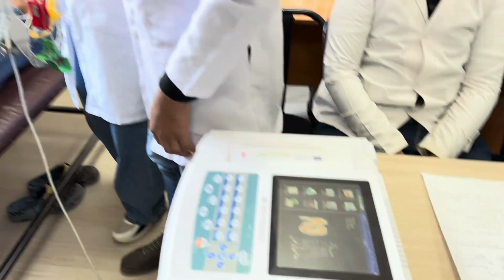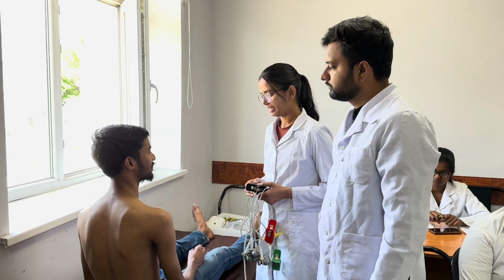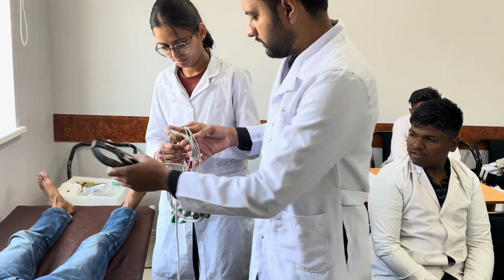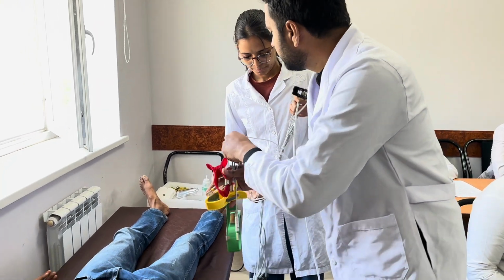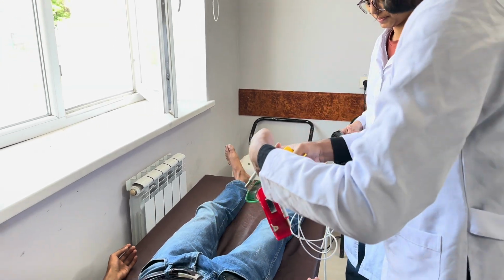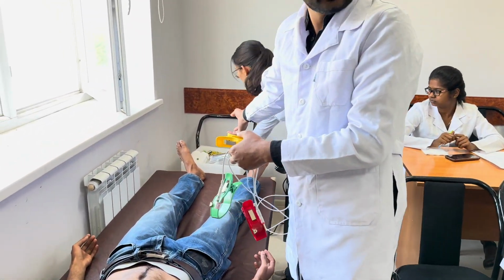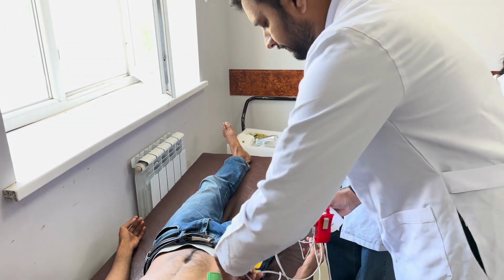If you are wearing any metallic elements like earrings or rings, or any electronic device with you, remove them. Okay. Then we start. Now, Samir, begin your exam, please. Ma'am, firstly we apply the jelly for reducing friction and for good conduction.